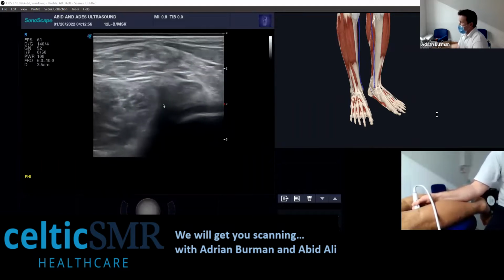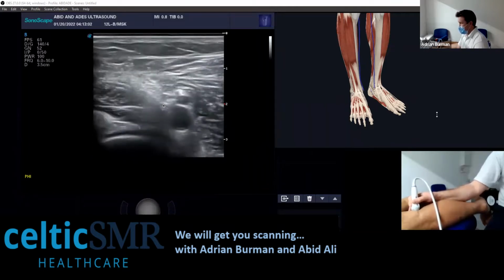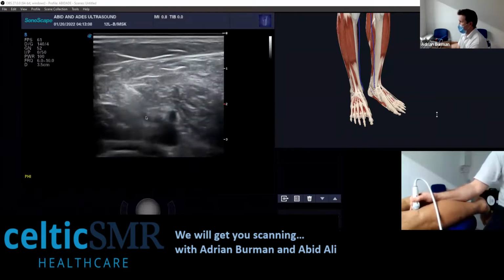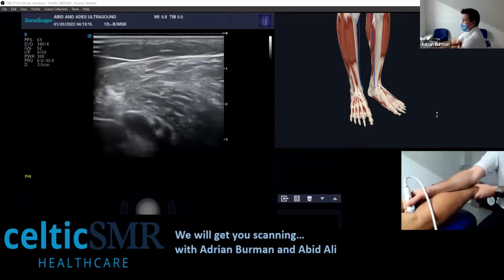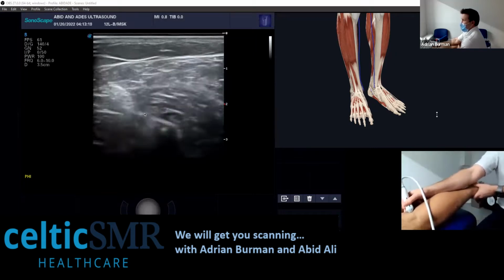So we're over in the medial fossa here. This is where they arise. So if you're over on the lateral side or in the midline, it's probably not. So here in the midline, we've got obviously the artery and the vein. If I just bend Abid's leg up, you can see that helps. And there's your popliteal vein there.